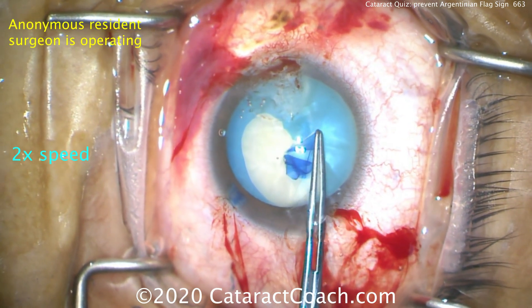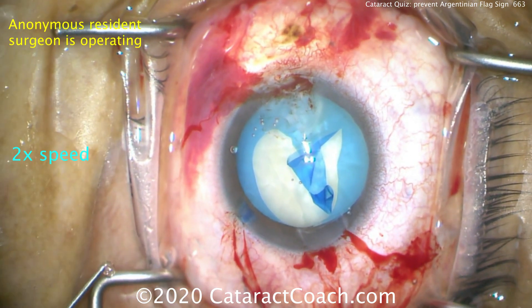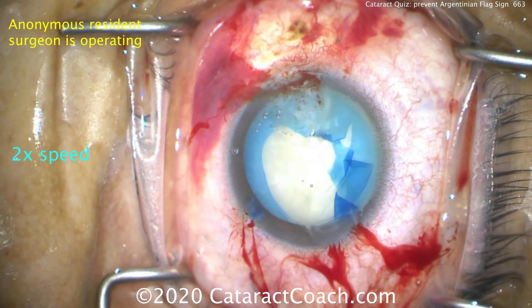Now that it's recovered, let's complete the rhexis. Just get it done. Doesn't matter if it's not perfect, as long as it's continuous. We don't want to have that weak edge from a run-out. Finish it up — even if it's ugly, even if it's irregular. As long as it's continuous, we'll take it.